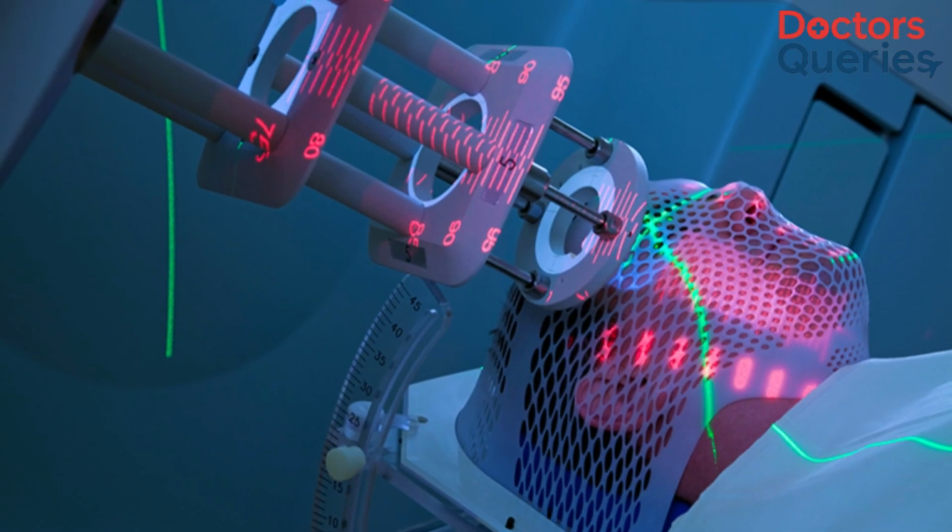The purpose of the mask is that the patient does not move during the treatment. As I said, we are planning for very precise radiation treatment. So when precision is important, it is also important that the patient does not move, and hence the mask is made. Many times the patient asks, is the mask to see that the radiation does not go to other areas? No, the purpose of the cast is only to immobilize the patient during the treatment. So the second step is the simulation scan and the cast, and after that the patient goes home.